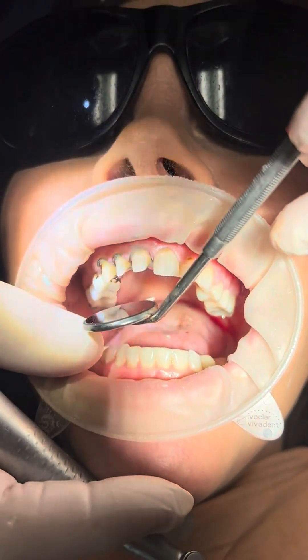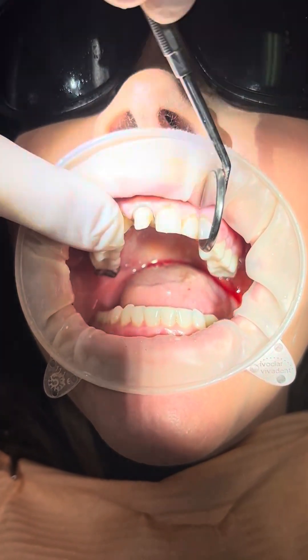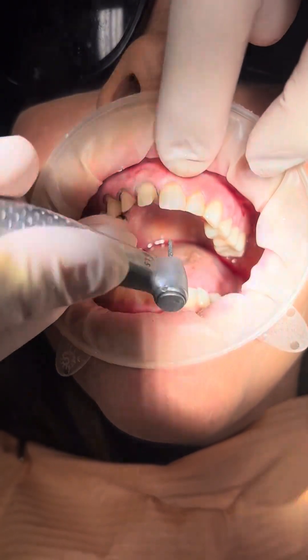We're looking at how much reduction we have from the buccal standpoint. So many people don't take enough off the buccal and roll the buccal in. So let me kind of just show you this.